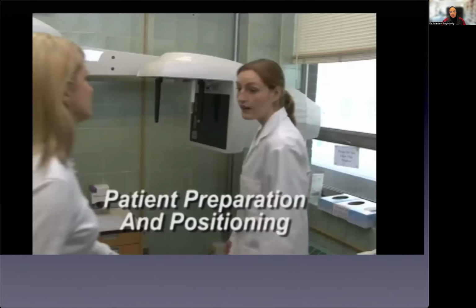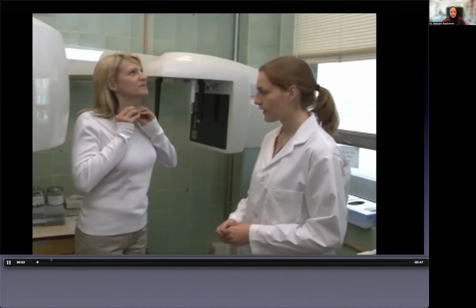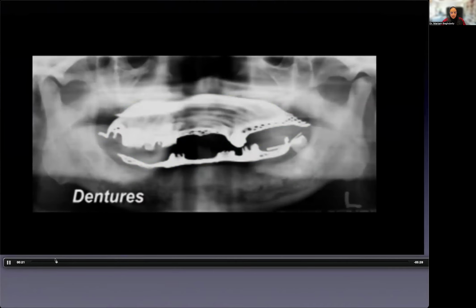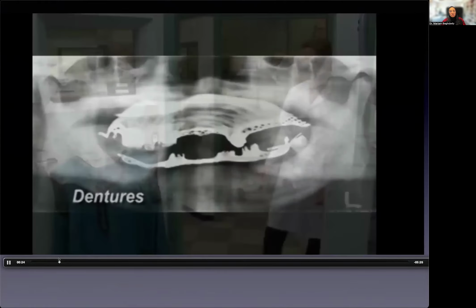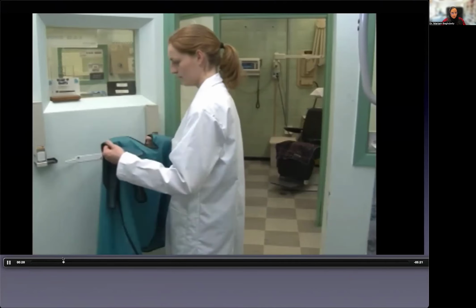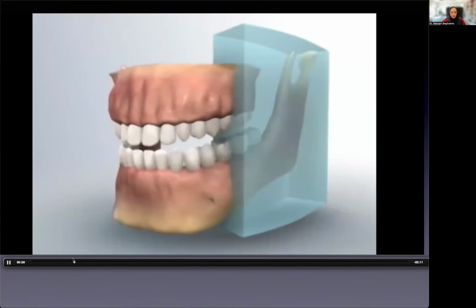And then we're going to start preparing the patient. So I'm just going to quickly remind you with this. Ensure that the patient removes all metal from the neck up. Okay, we already talked about this. We talked about earrings and their ghost images, removable dentures. I see this so much. People will forget to ask the patients to remove their removable dentures. So dentures need to be removed. Never use the thyroid collar. Never use the thyroid collar. We can still be using the shield again in Kuwait.